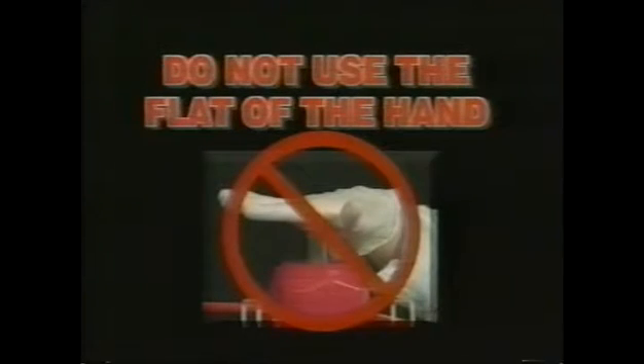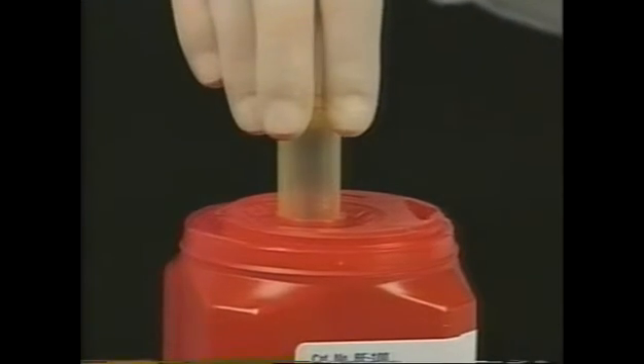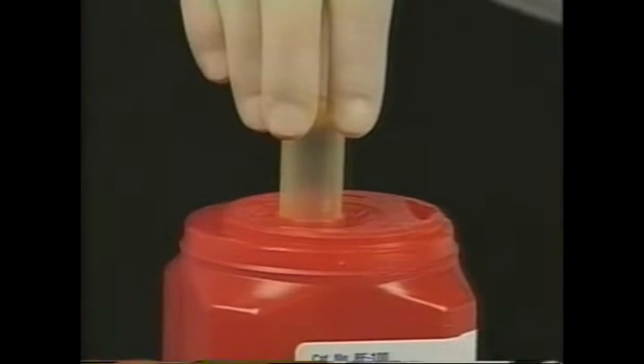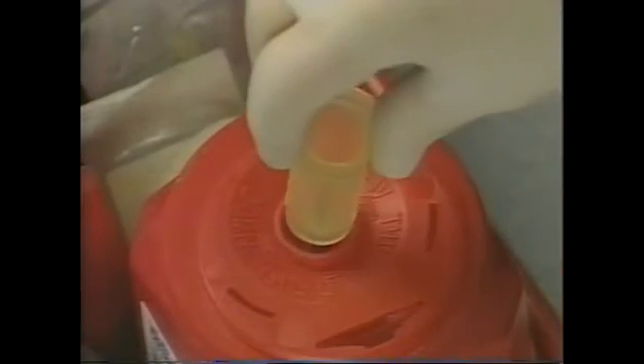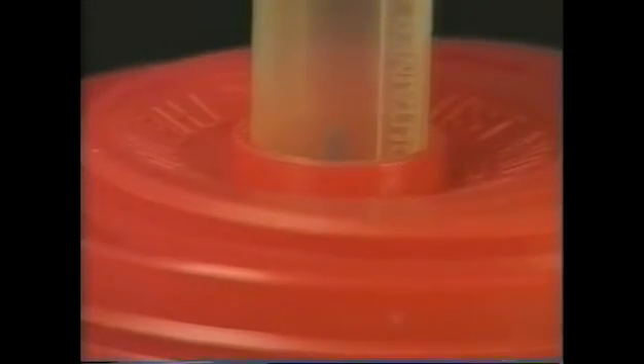Do not use the flat of the hand to operate the AND unit. Always grasp the holder by the flanges, slightly twist to the left, and slowly push to the end of the stroke, making certain the needle has been safely deposited into the container. Remember, listen for the three clicks as you push down. Do not put the holder into the top AND opening at an angle — always insert the needle holder vertically, as perpendicular as possible. A raised ring has been incorporated into the AND top to help insert the needle holder upright.